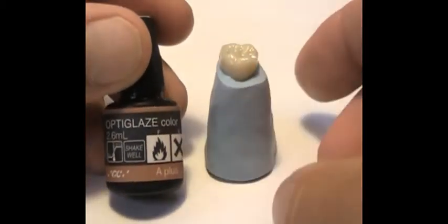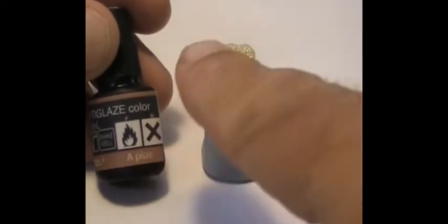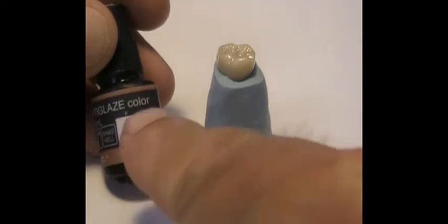This is a very monochromatic A1. The nice thing is if you have A1 pucks or A1 self-curing resin like PMMA and you want to colorize your temporaries, using the OptiGlaze color kit you can use the A+, which changes and darkens the shade. They have an A+, B+, C+. In this case, because we have an A1 unit, we're going to change the shade from A1 to A2.